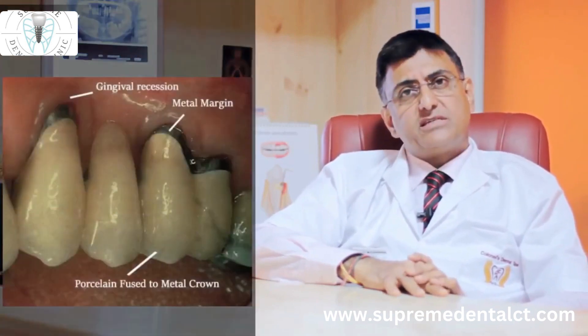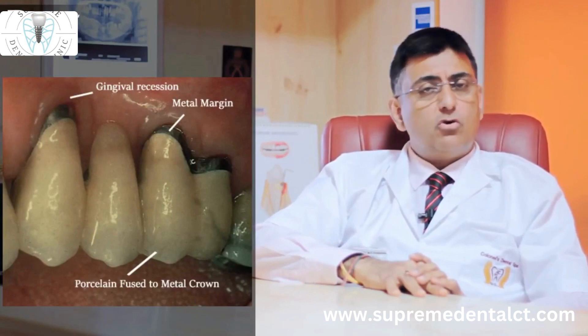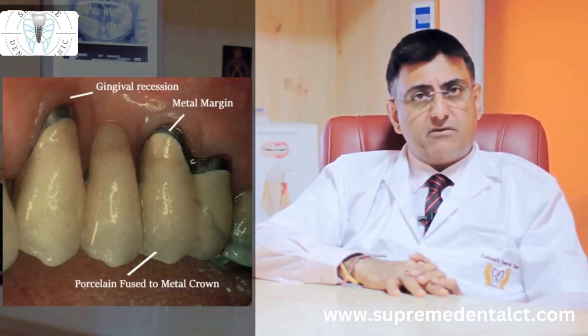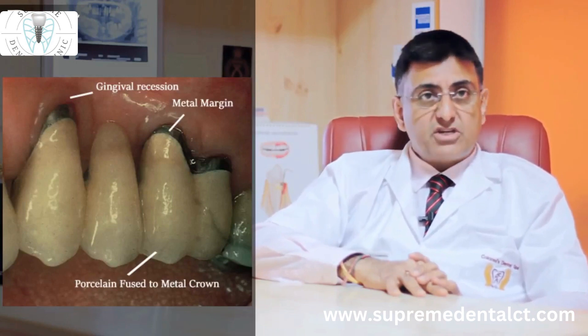The dark line which is seen around a metal ceramic crown is no more seen in all ceramic crowns. This dark metal line will also sometimes lead to recession of the gums.